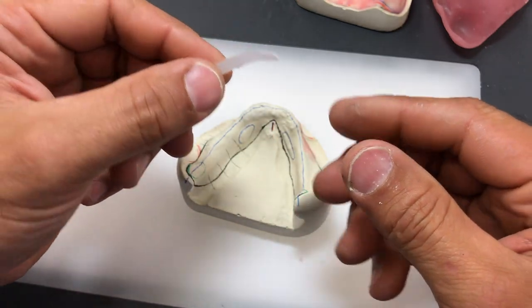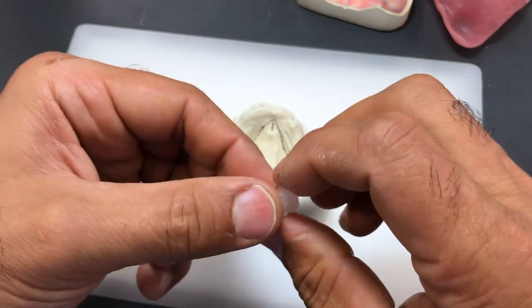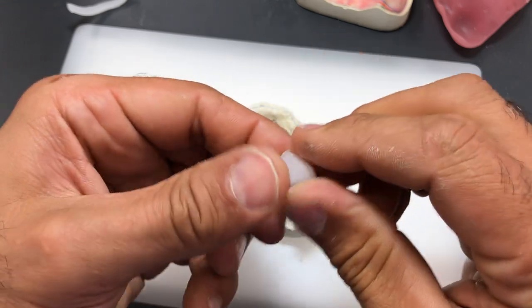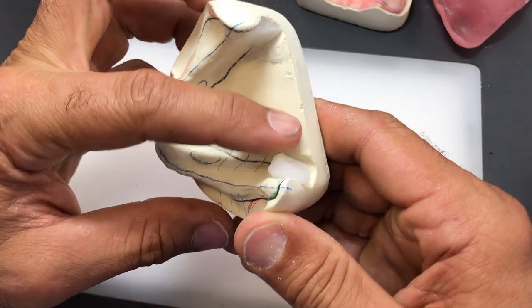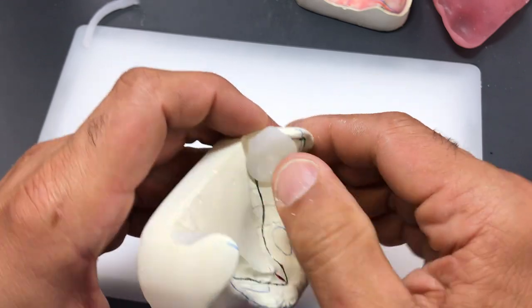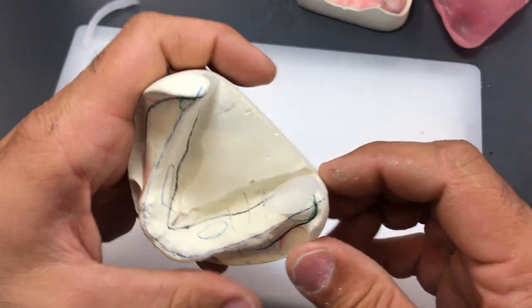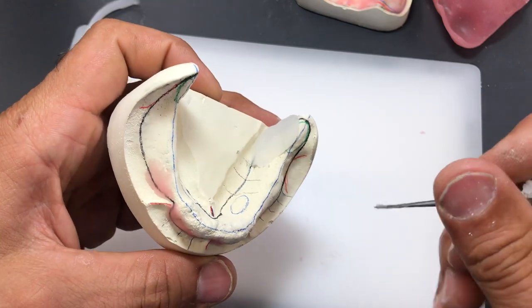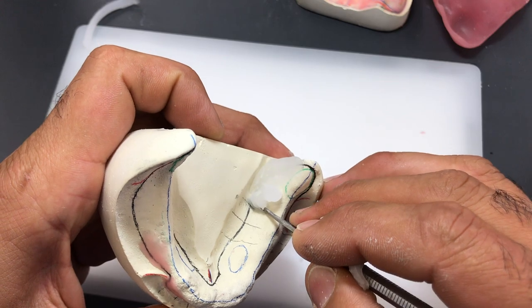Take a little bit of utility wax, roll it into a little ball, something like that. Pinch it together. And once again, pinch it up against the area that you're trying to block out. And then go back and carve it.